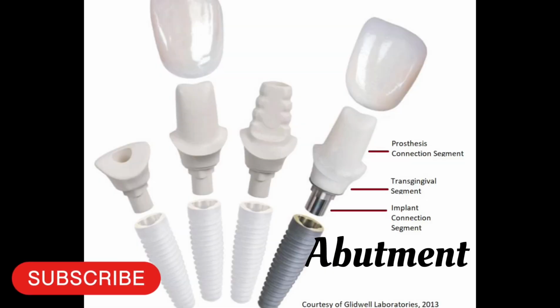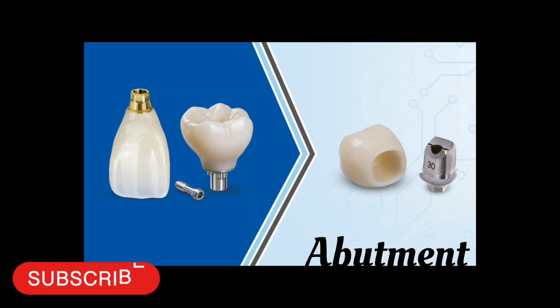Now we will discuss about the abutment. Abutment is the portion of implant that supports or retains prosthesis or implant superstructure. There are three main categories of implant abutment.